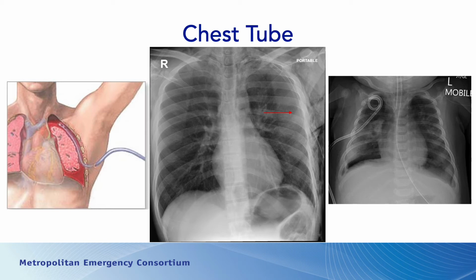And if you follow that bright white line near the top of the tube, near the apex, you can actually see where the line has a disconnect. That's an opening. That's a port. That's one of the holes within the chest tube. On the right-hand side, it's a child. It looks like the child's intubated and has a nasogastric tube, but you also see, on the child's right-hand side, or the left-hand side of the image, a pigtail catheter.